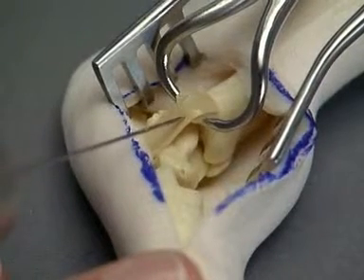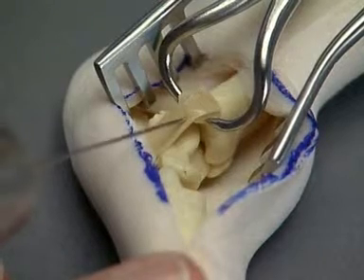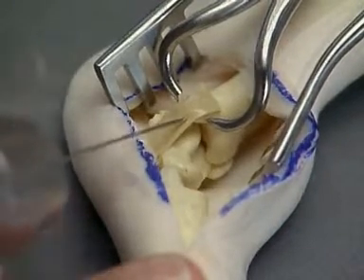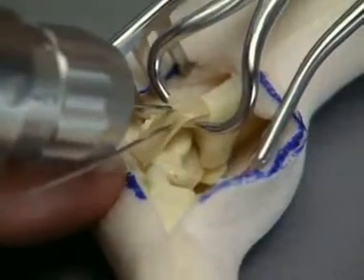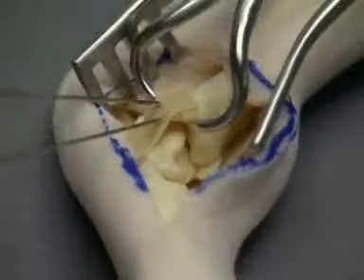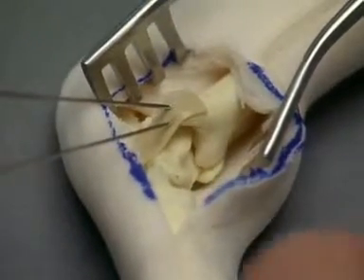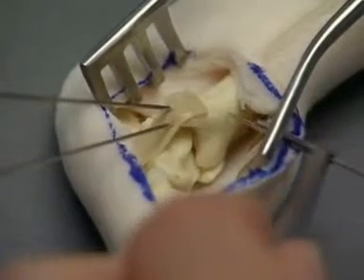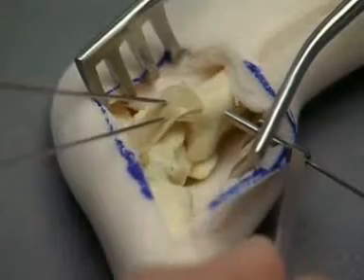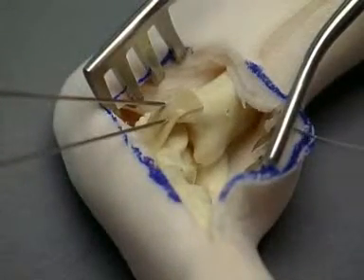Two 1 mm K-wires are inserted from the medial malleolus into the tibia. Alternatively, the K-wires may be introduced in a retrograde fashion. The tension band is completed with a 0.6 mm cerclage wire formed as a figure of 8. The protruding K-wires are cut and bent.